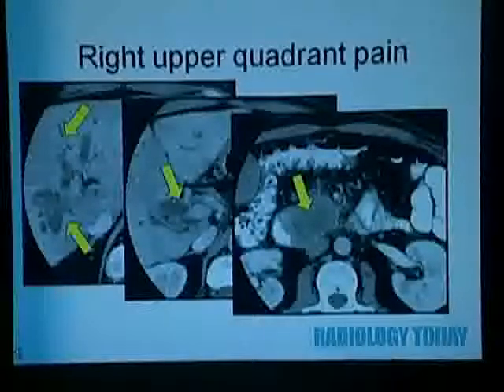We looked for local regional nodal metastatic disease. There's also a chest, abdomen, and pelvis CT that was done with it. And this particular case had greater than 180-degree abutment to the superior mesenteric artery on other images. It was non-resectable.